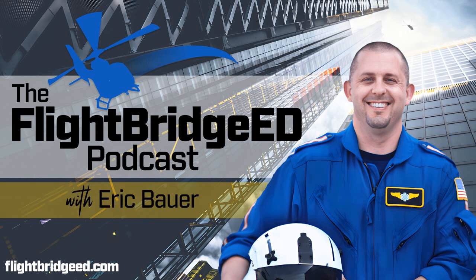A good analogy of PEEP as it relates to your alveoli: imagine blowing up a balloon, those little itty-bitty balloons you blow up at a party, and how difficult that is to blow up. I know I have a really hard time even blowing one up. Well, once you blow it up, they're easy to continue to blow up. You usually don't have a problem. Well, that's kind of how alveoli are.